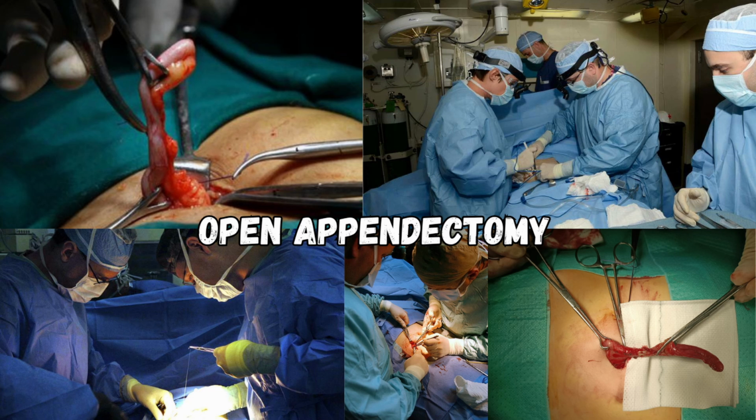Step 8. Irrigation and inspection. The stump is inspected for bleeding or leakage. The peritoneal cavity is irrigated with warm saline, especially if there has been perforation. A suction device or bulb syringe is used to remove debris or contaminated fluid.